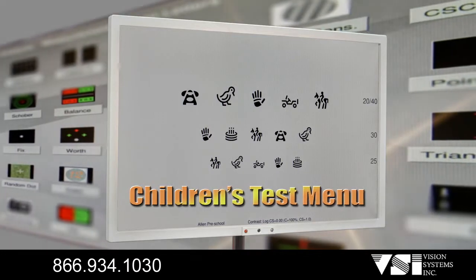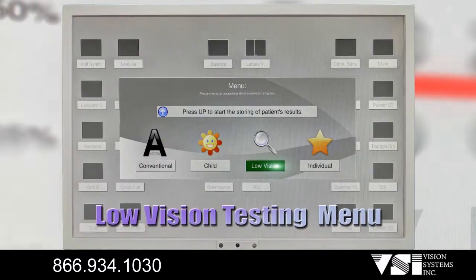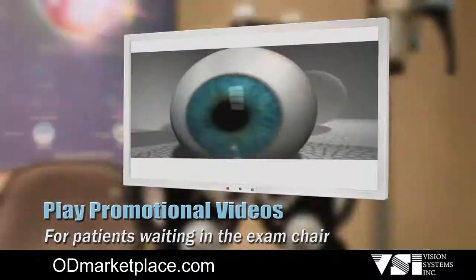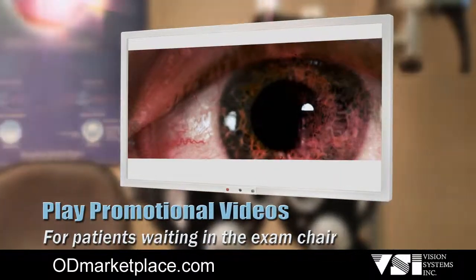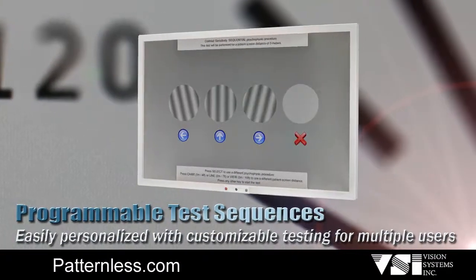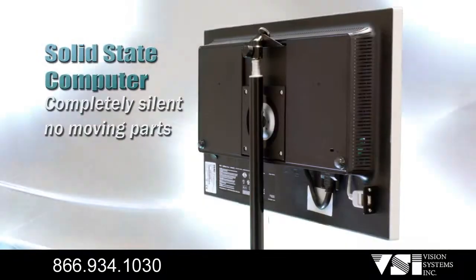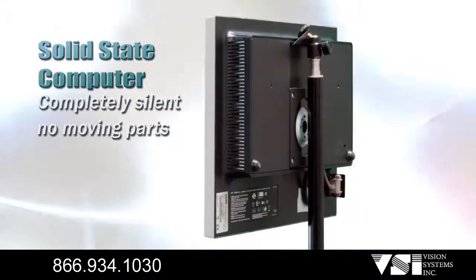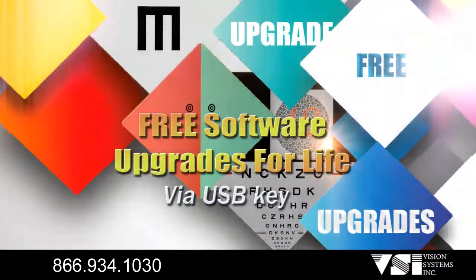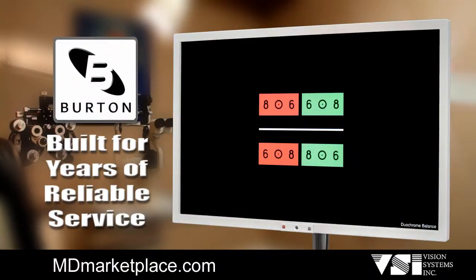The Clearview 2 also includes a children's test menu, low vision testing menu, children's animation and stereo sound, the ability to play promotional videos, programmable test sequences for multiple users, ergonomically designed remote infrared control, solid state computer — completely silent with no moving parts — and free software upgrades for life.